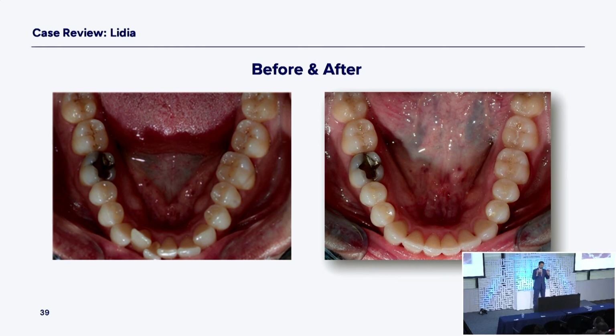So yep, it's nice to look at the front teeth and they're straight. You could see the calculus from the pre-picture, the teeth where they trap the calculus. Look at the red gum line, the irregular gum tissue, and look at the gum tissue now, and the lingual, totally remodeled. Even your lingual gum tissue will totally remodel to full gingival architecture, and now they don't trap as much calculus. But your molars are upright.